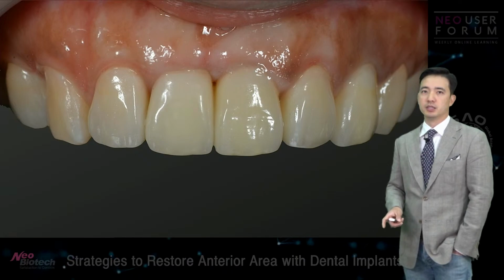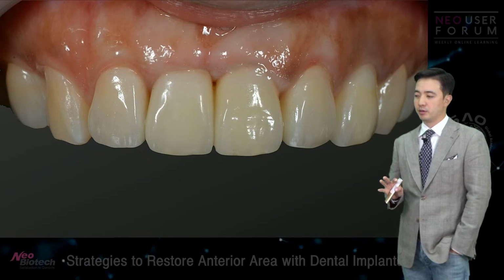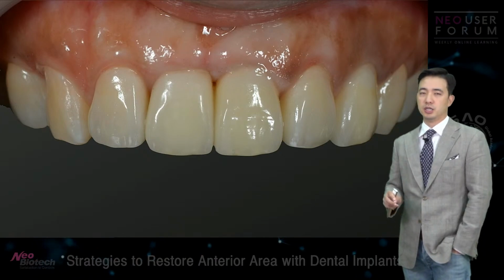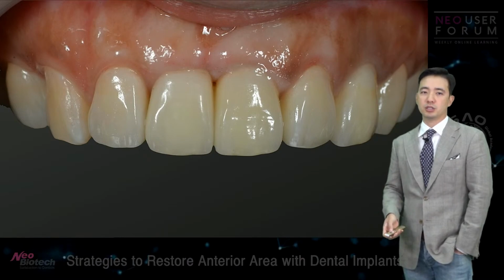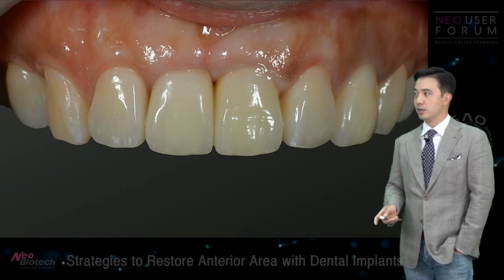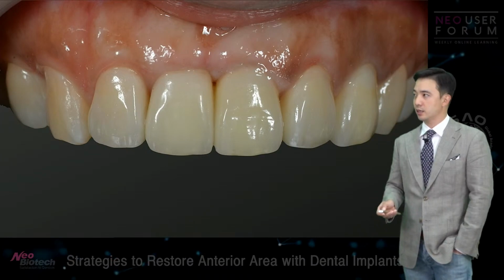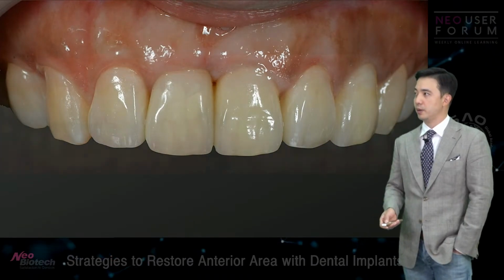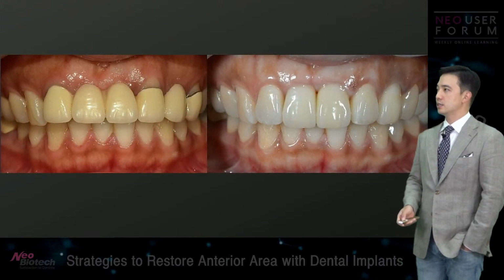So what I think is the cold cure acrylic provisional restoration, the surface of it is very porous and the soft tissue doesn't like it. But with the zirconia surface, we kind of gained the soft tissue back. So this is how we started, and this is how we ended.